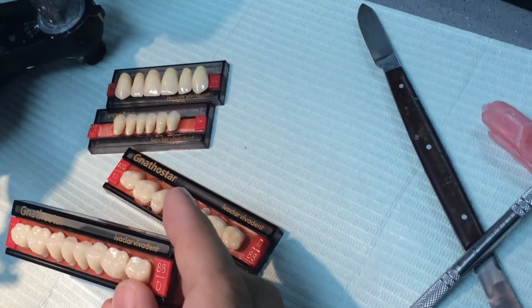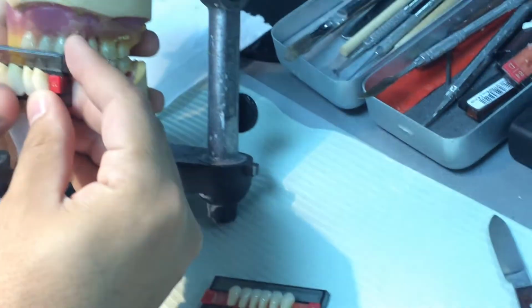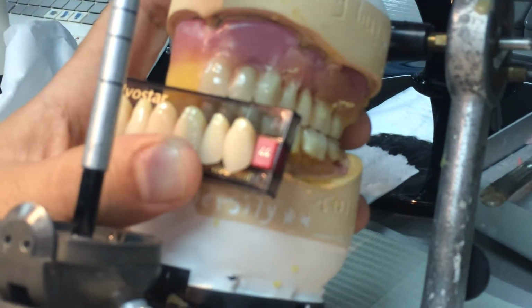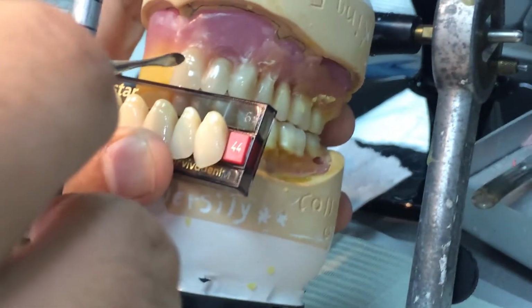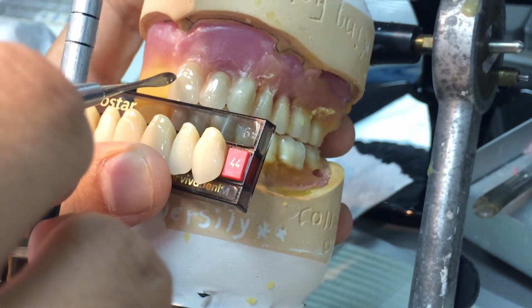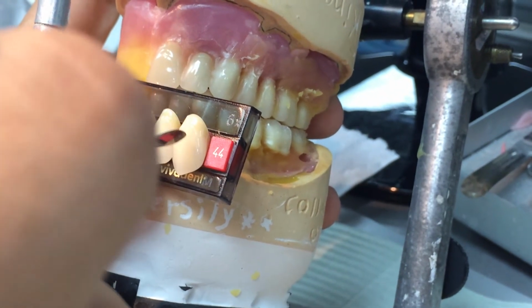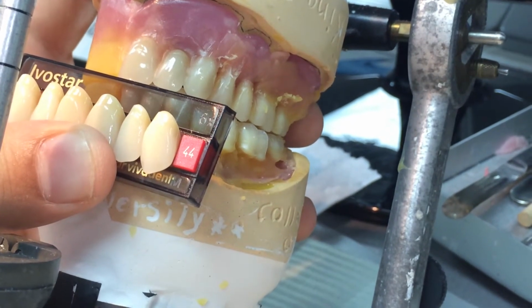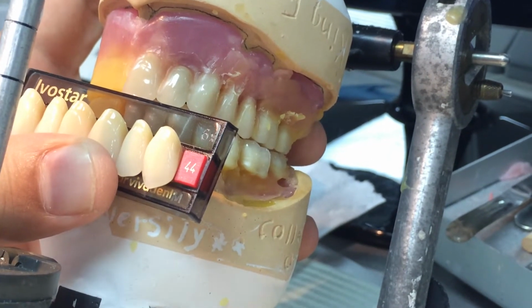Regarding the side of the teeth, you're going to follow the same idea. I'll take this teeth set and put it on the articulator here. So this central is going to be on the same side here, this lateral is going to be here, this canine is going to be here. The same area, same side for the teeth, for the set. Clear?